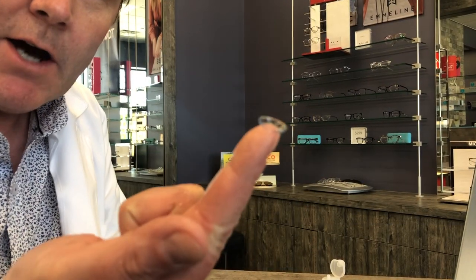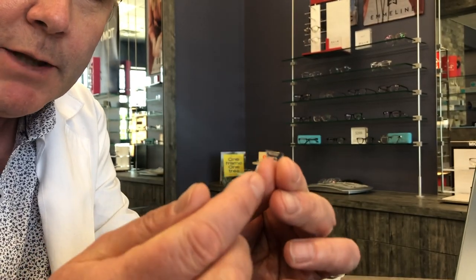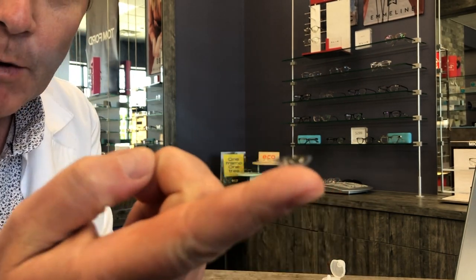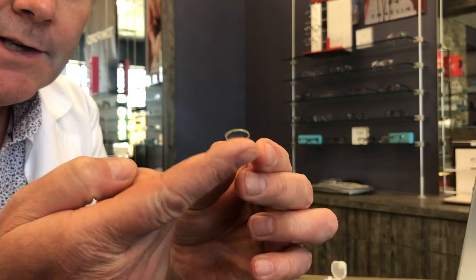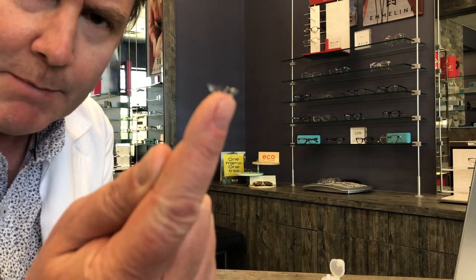One tip when placing the contact lens on your finger: if you place it close to the end of your index finger that's going to make the lens easier to place onto your eye. If you place it more on the fleshy portion of your index finger, it's going to be harder to insert the contact lens. So place the lens up on the tip of your index finger.